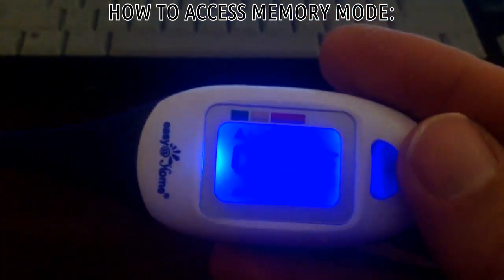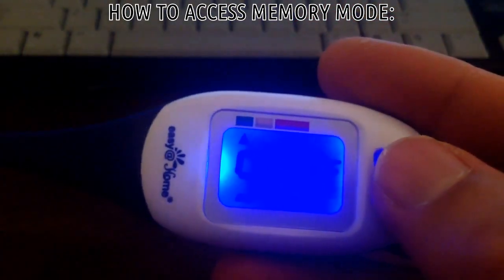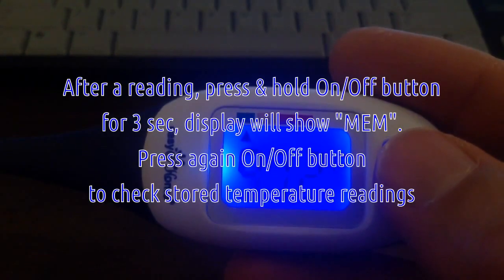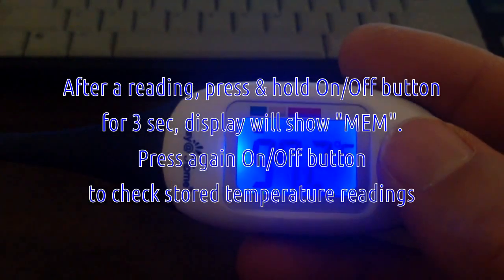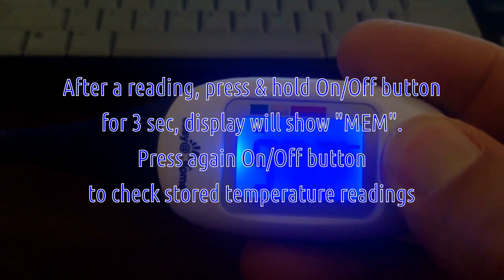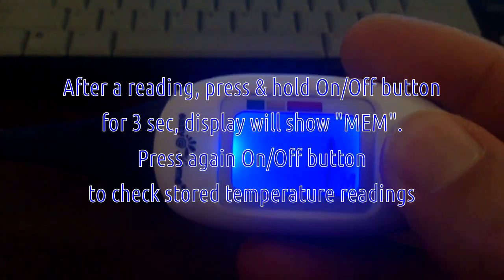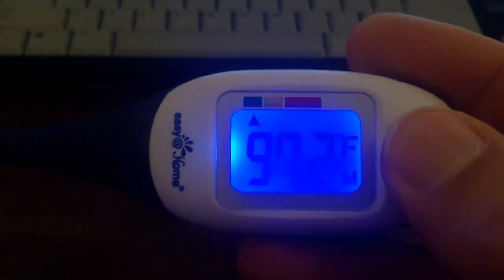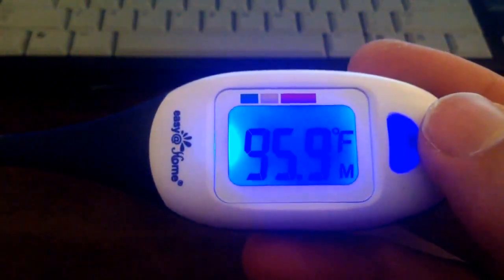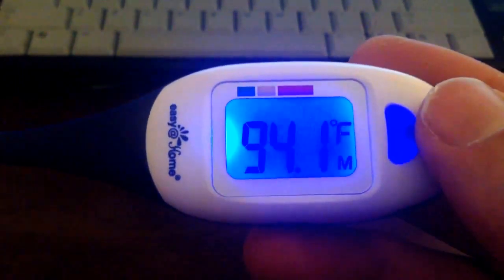The memory mode is not complicated to access, but if you don't know how, it can be hard to figure out. The only way to see your previous readings is to measure first. Once you get the result and hear the beeping, press the on-off button for 3 seconds until you see 'M' for memory. Then press the on-off button to advance through your stored readings.